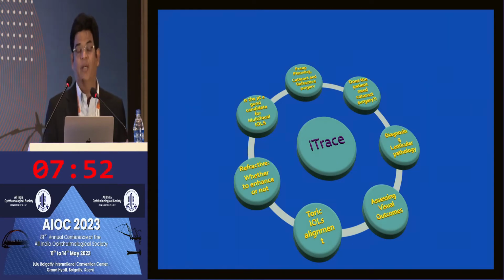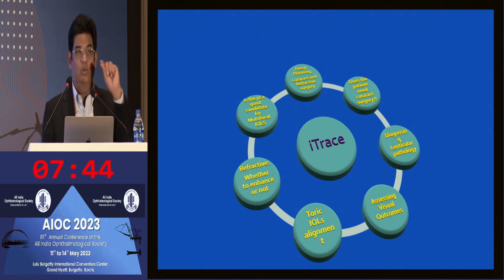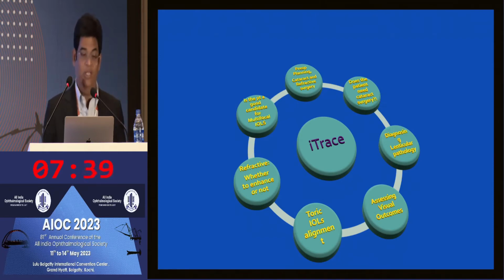One comment is that you must take precautions when we are doing the ray tracing. The patient has to look through a distant target and relax the accommodation. That's how you will get the most reliable readings.